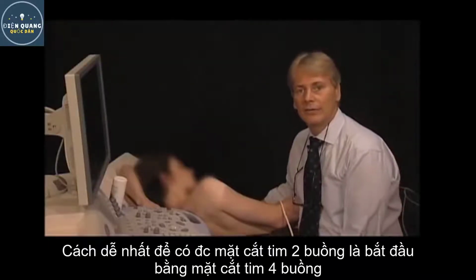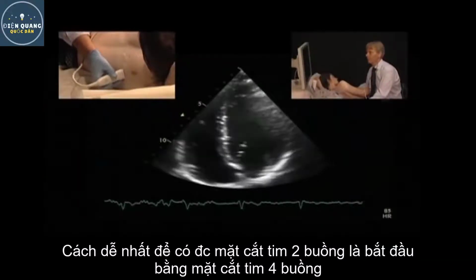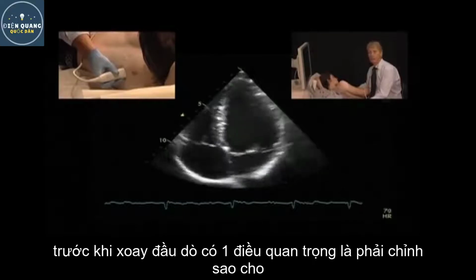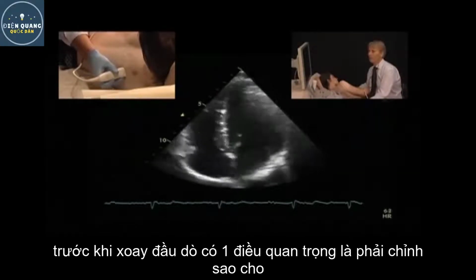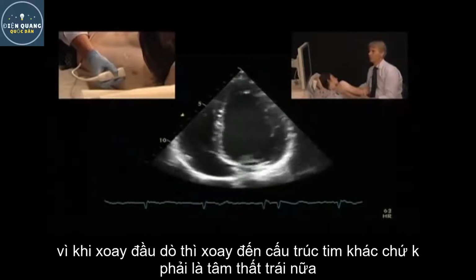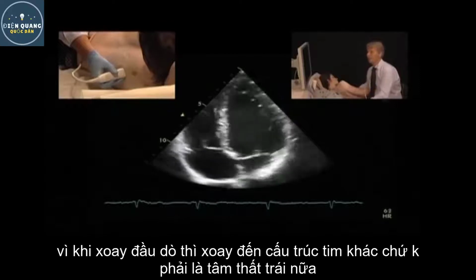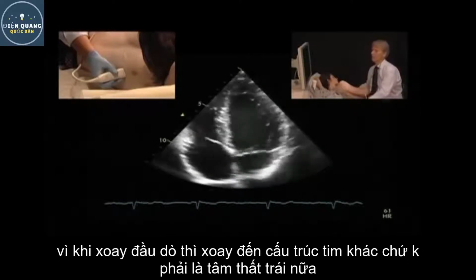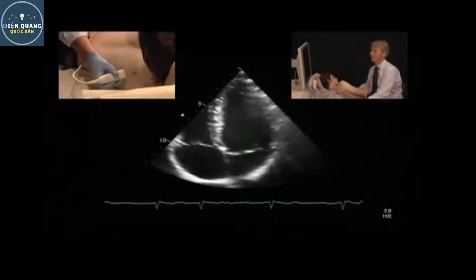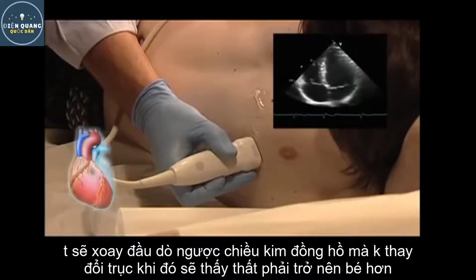The easiest way to get to a two-chamber view is when you start out from a four-chamber view. So this would be the four-chamber view. But before you rotate it, the most important thing is that you have to try to get the ventricle right in the middle, because when we rotate, we will be rotating around that middle. And if you do not put the left ventricle in the middle, you will be rotating around different structures and not the left ventricle. So now we have the ventricle in the middle.